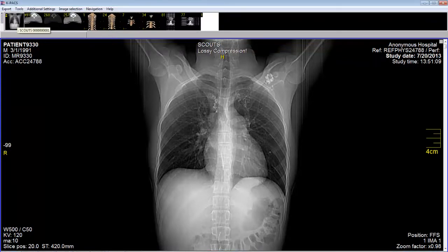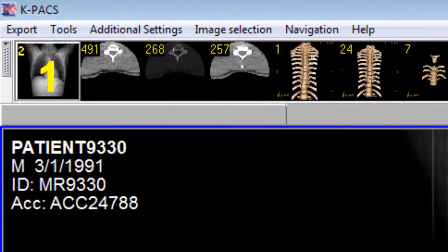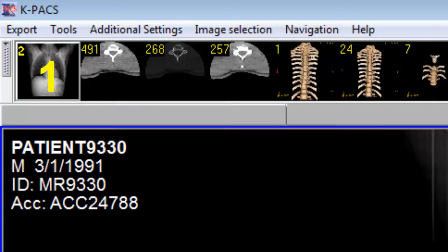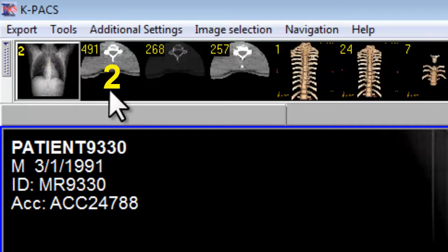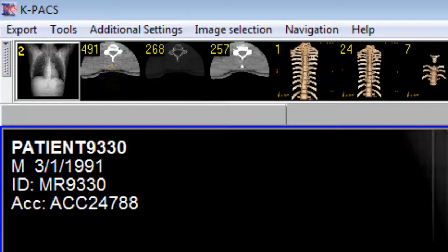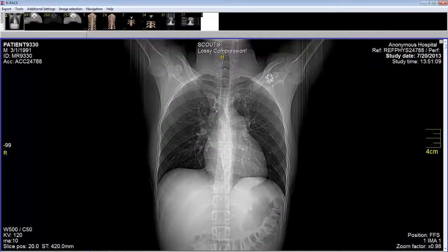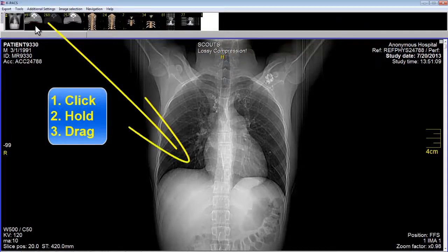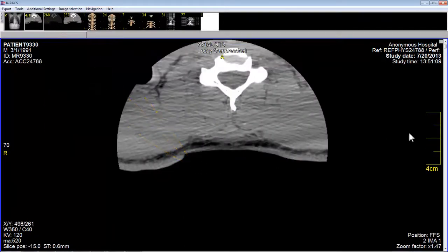Typically, a scout will be the first image in the series of thumbnails. The second image is axial sections. Typically, the second images will be the raw axial sections that were scanned from the patient. How do I load in these axial sections? It's very simple: I left-click on the thumbnail, hold down, and drag. And there are the axial sections.